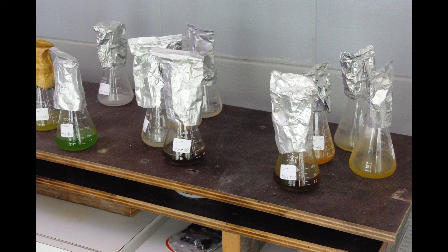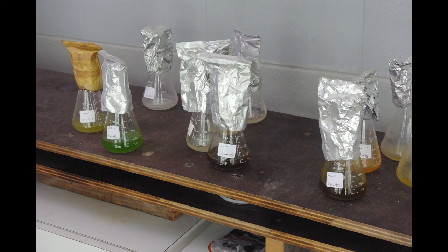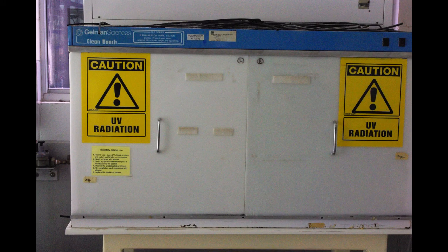Starter cultures of TISO can be obtained from CSIRO in Tasmania. UV light can be used to sterilise bench space before subculturing.